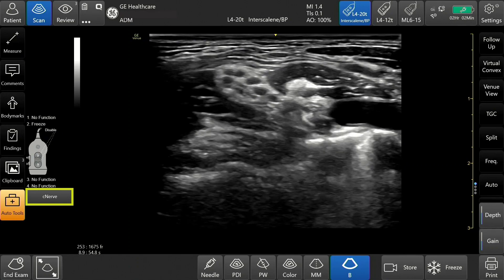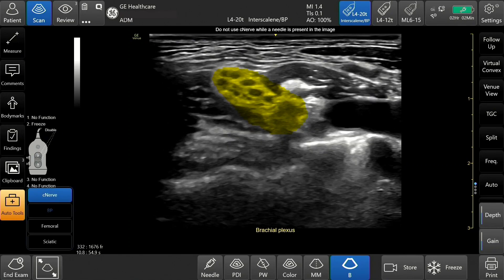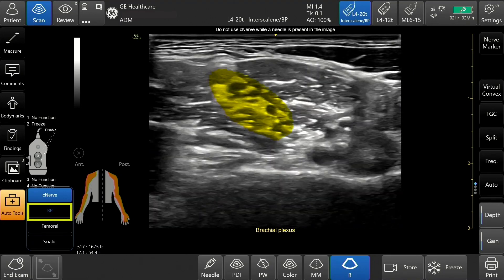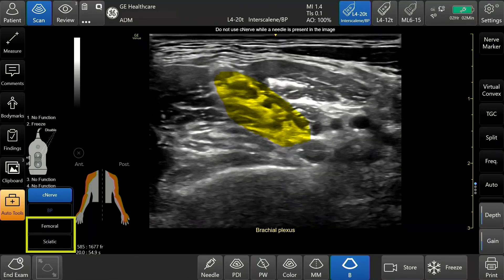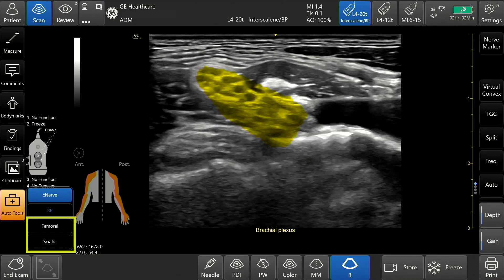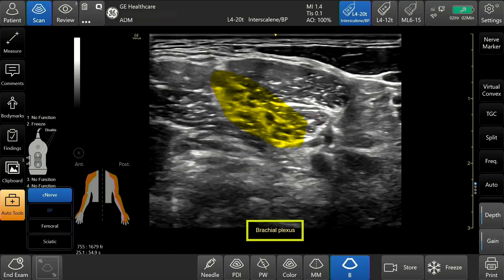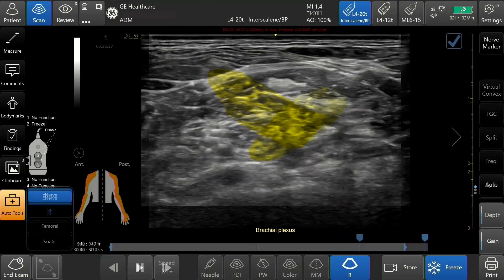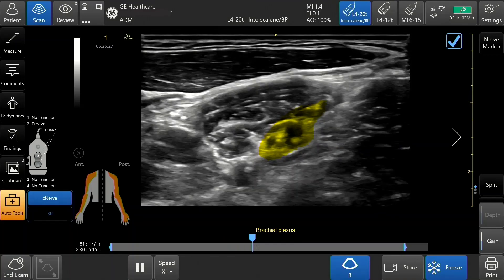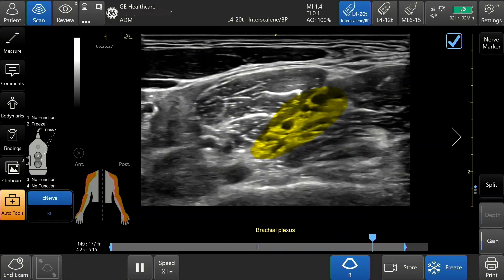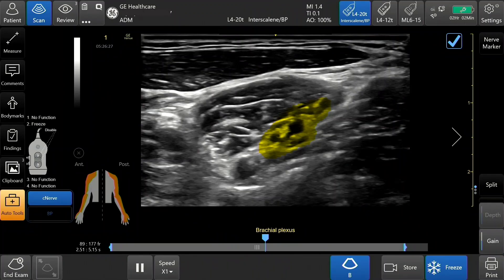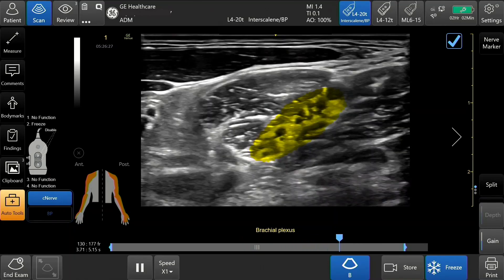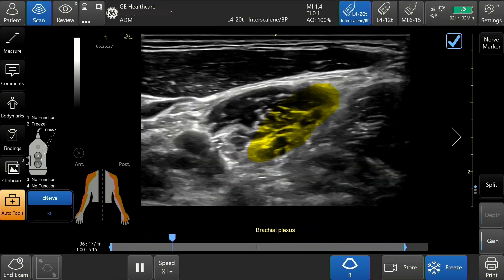Tap C-Nerve on the bottom left corner of the touchscreen. The BP, or brachial plexus option, will be highlighted since you are using the interscalene preset. The femoral and sciatic options are also listed below brachial plexus. The name of the selected procedure button is also found at the bottom center of the image. During live scanning or while reviewing a stored clip, C-Nerve highlights the nerve block site with a yellow colored overlay on and around the nerve, differentiating the nerve from the surrounding anatomy.